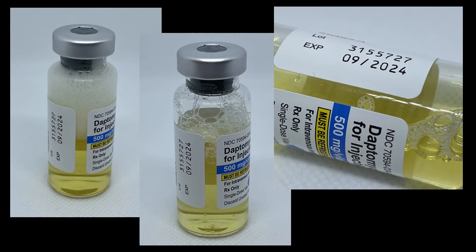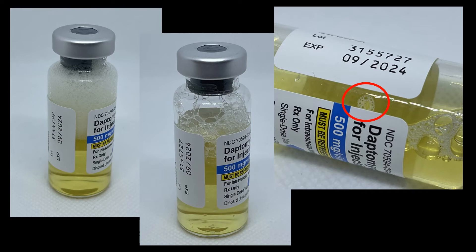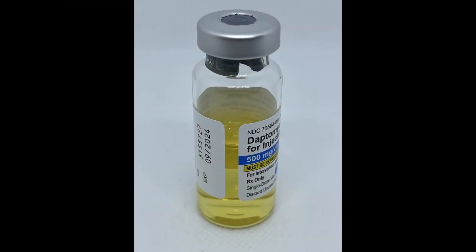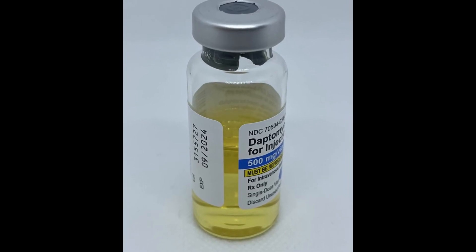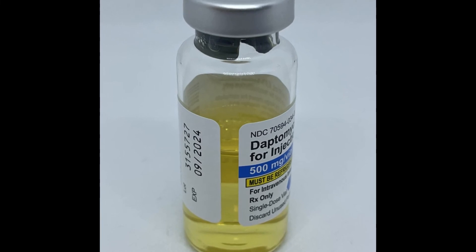Here are some images of what the vial should not look like at the end of reconstitution. Foaming should be minimized if possible; although foaming does not cause drug degradation, it does extend the reconstitution time. Additionally, there should be no clumps of undissolved powder remaining in the final solution. The final solution should be a clear, uniform, light yellow liquid free of any particles or chunks and with little to no foaming.